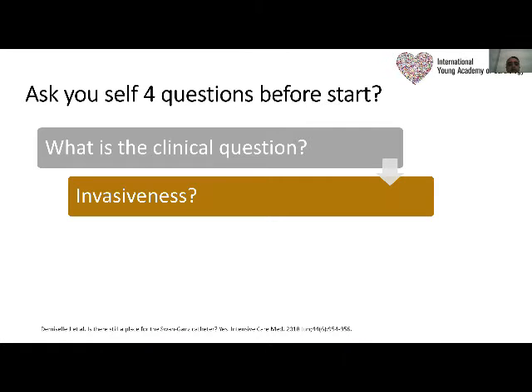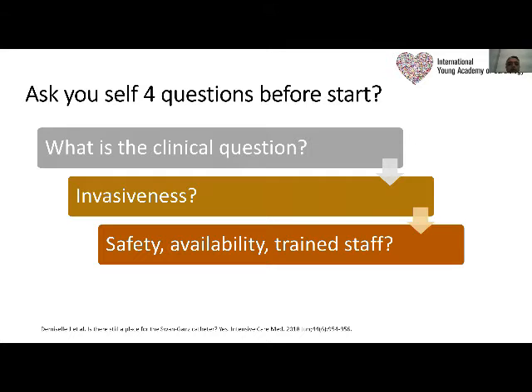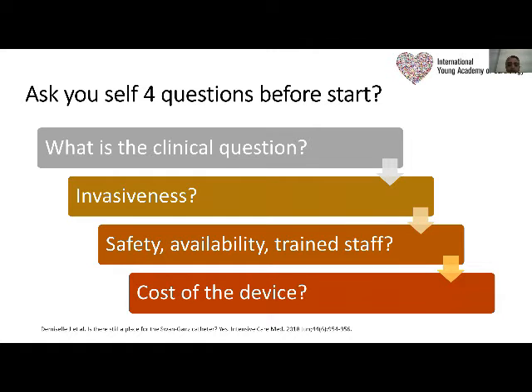I should start with non-invasive or minimally invasive monitoring first, before jumping to the more invasive one. I should also check if I'm competent enough to insert the catheter, and competent enough to read, deal with the measures and numbers or not. Do we have trained staff, especially a nurse in charge and well-trained nurses over the night shift? It's very important before starting some invasive monitoring. The cost of the device is also an important factor in some hospitals.